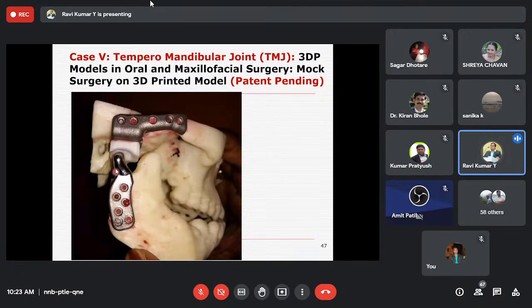And of course, wherever you have the load bearing, you cannot get a mirror finish from the machine. So you may get this sort of finish, but that doesn't matter over there. But it may matter here, where the load and your biting force will come, and where you have a mirror finish here.